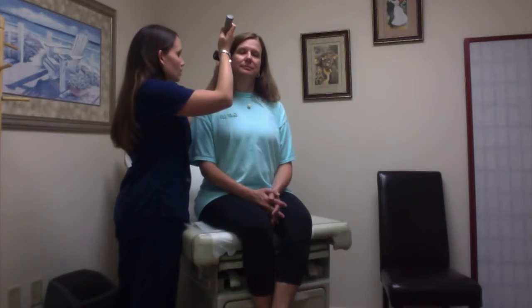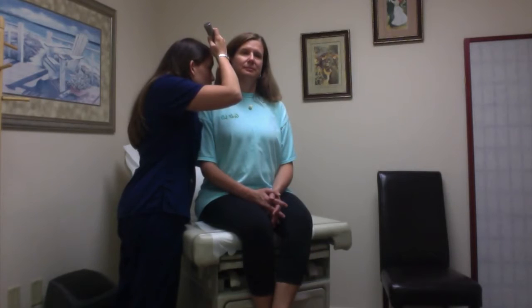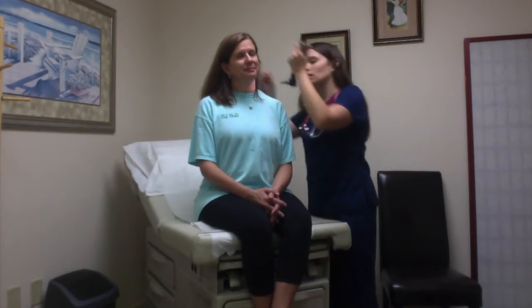Make sure my light's on. So I'm going to pull your ear up and slightly back, and I'm going to look into your ear canal. Once again, assessing for general hygiene. Any cerumen buildup, discharge, redness, lesions, foreign bodies. I'm looking for the tympanic membrane to be pearly gray, and I'm also looking for the cone of light. Just like on both sides. Awesome.